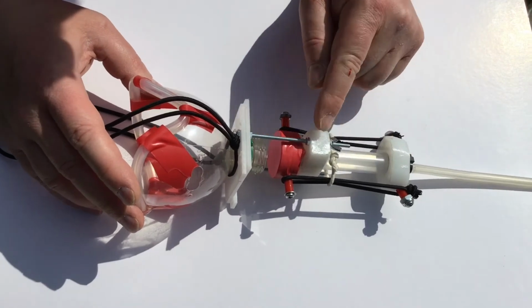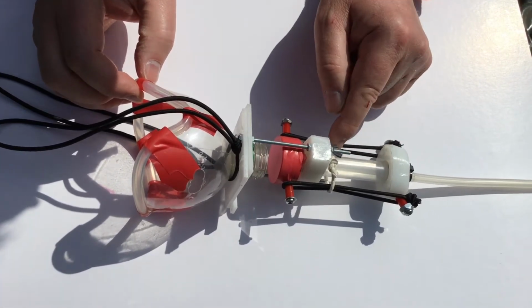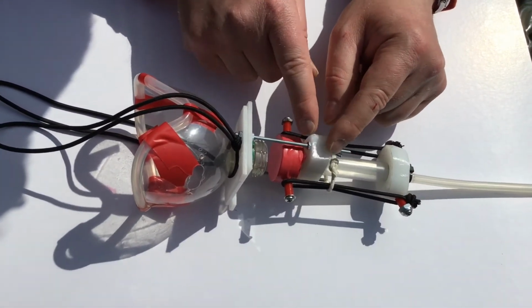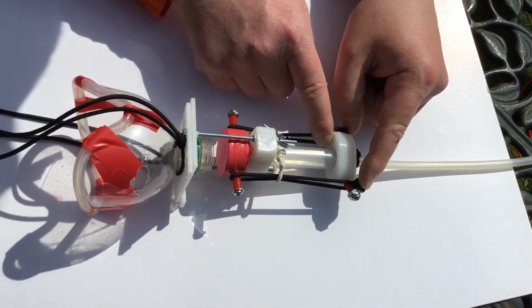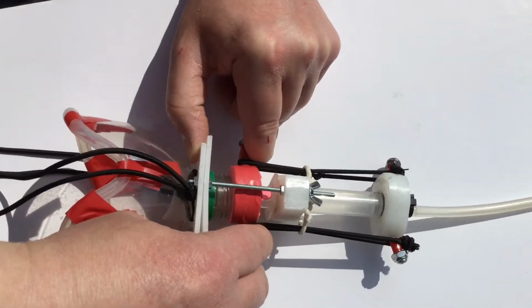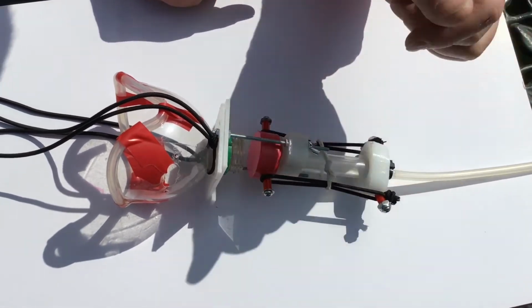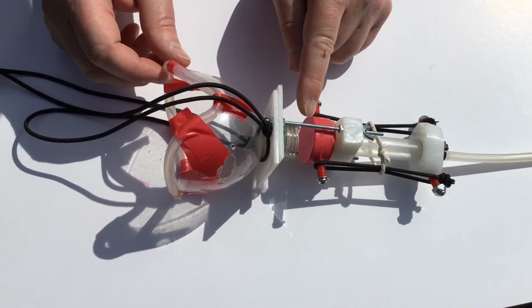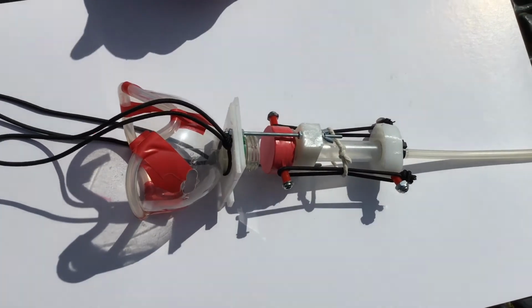Here we have 3 plastic elements that were fabricated to convert the syringe into a primitive valve. Here we have the valve seat and the attachments for the return elastic. Here we have the holder of the syringe, and here we have the rear end of the elastic attachments. So the valve shuts off and then opens, shuts off and then opens, shuts off and then opens. A little bit of string here just helps ensure that these elastic straps don't unclip from the ends of the arms. The rubber material on the face of the valve is simply a balloon stretched across the surface to improve the sealing quality when the valve is closed. Okay, let's see it demonstrated.